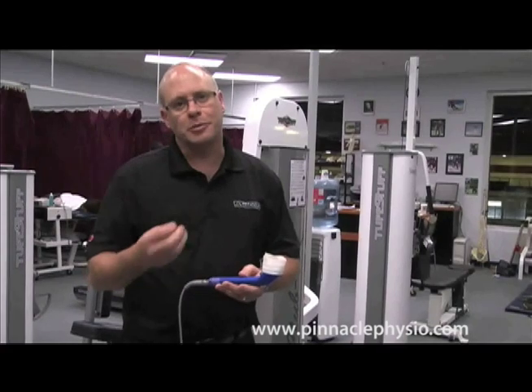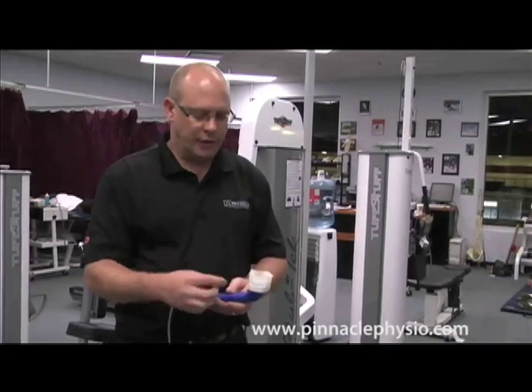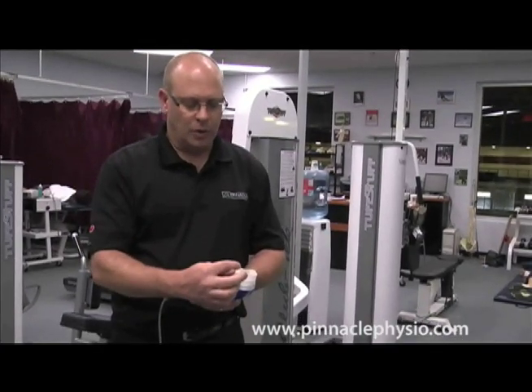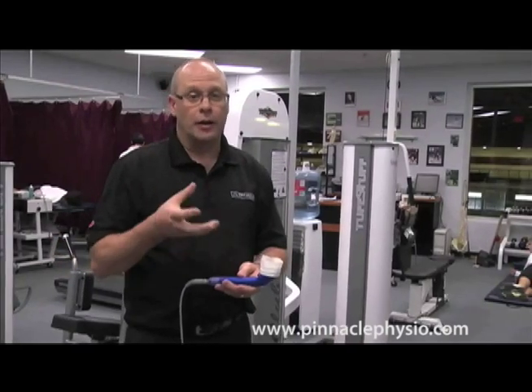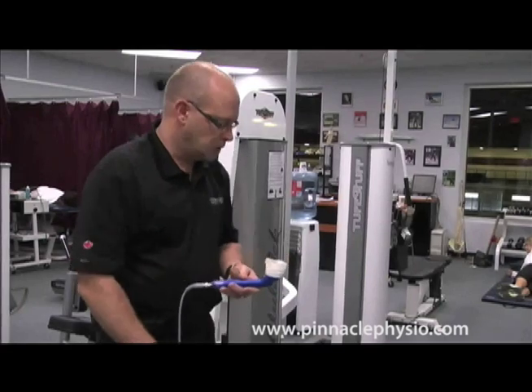Let me show you how ultrasound works — it really helps patients understand what we're trying to do if you can see the mechanics. What I've done is wrapped the ultrasound head with tape and filled it with a little bit of water, so you can actually see the effect of the sound waves. Your body is eighty percent water, so you'll see how you get that vibration effect from the ultrasound machine.